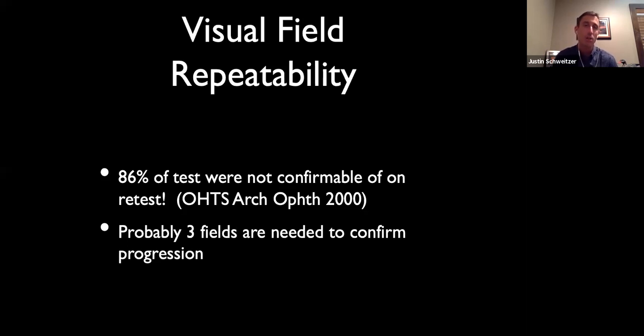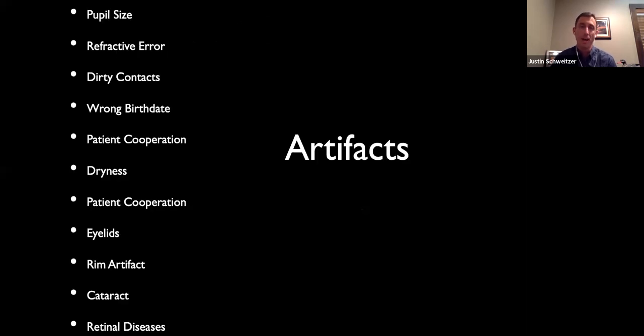And it's not always feasible to get that many visual fields, but we try to. We try to get it before we make an ultimate decision on that.